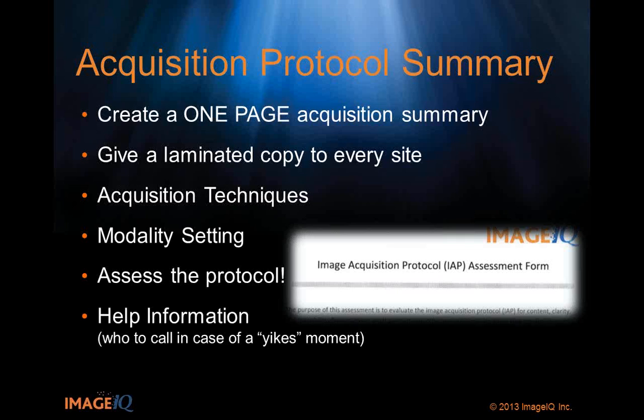What modality settings they're going to put in there, and this is sort of backwards, but what they really should do is assess the protocol. Have them look at the protocol before the trial even starts, because they're the experts on their particular machine. They've been scanning on this GE scanner for the past 10 years. They know what it can do. So if you give them this protocol, they can tell you really quickly that, oh, I can't get that field of view, or yes, there's going to be an issue positioning this patient this way for the scanner. So let them see it and let them become comfortable with it.